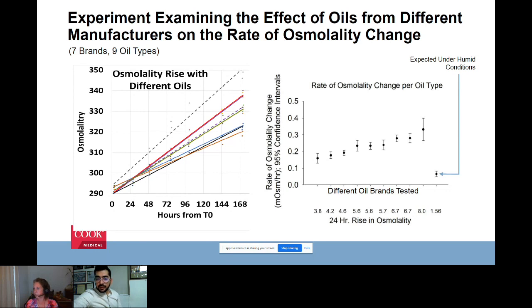I'm looking here and I see that someone said that changing on day 3 in a dry incubator gives a good blast rate with one step from Chile. Yes. Yeah, that's what's expected, but we need robust data for it.